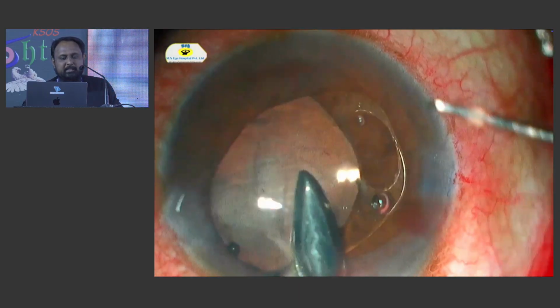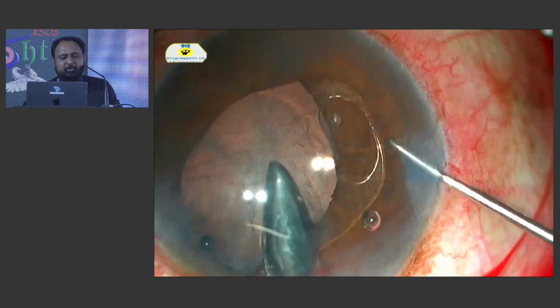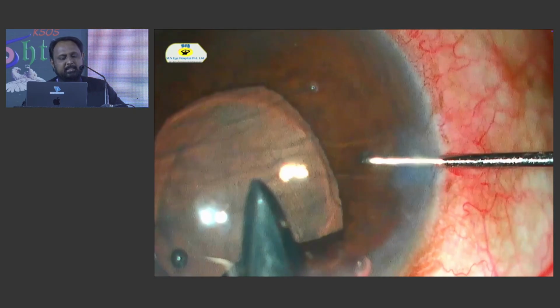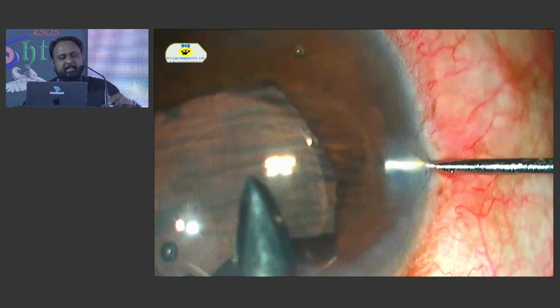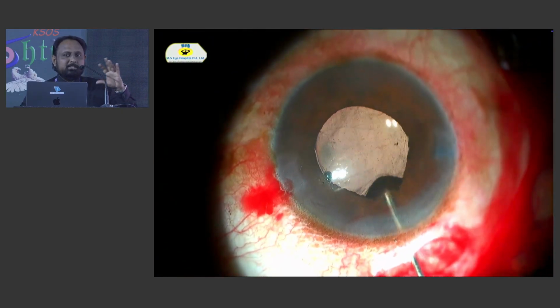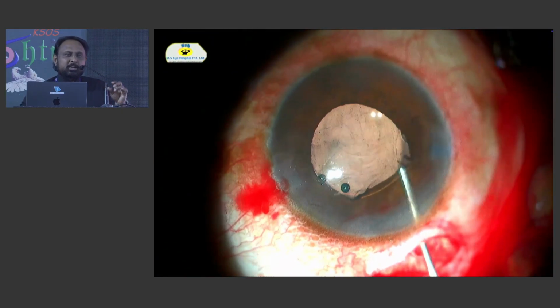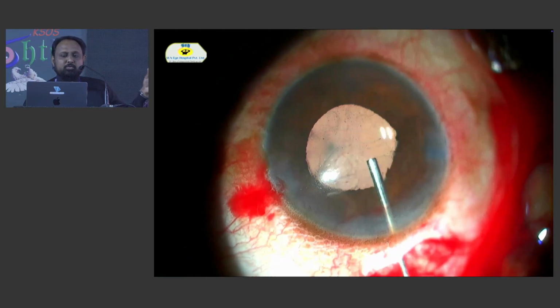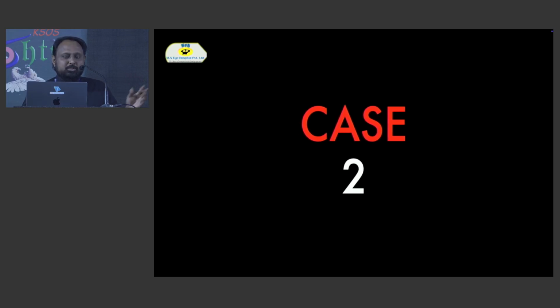Now moving on to the other side, you see here again my hand is going to the mid periphery where I want to actually clip. Then I take the IOL inside, slightly raise the left hand, and the right hand pushes down. You'll see the small dimple. As long as it is the mid periphery, you get nice round pupils. If you come very anterior, you get these cat eye kind of pupils, and don't go too peripherally because you can damage the root and cause bleeding.